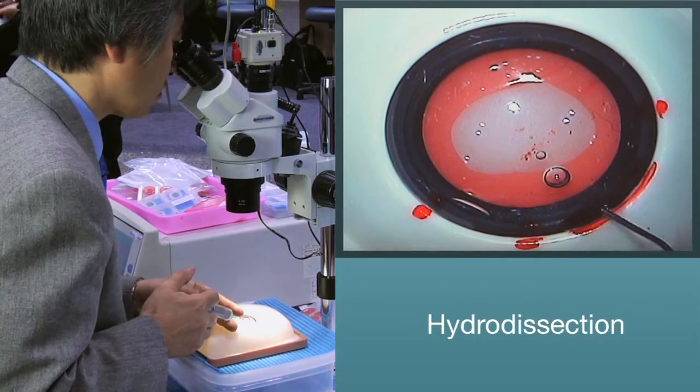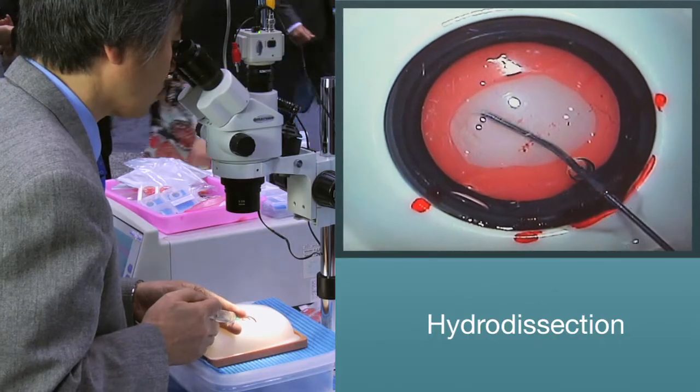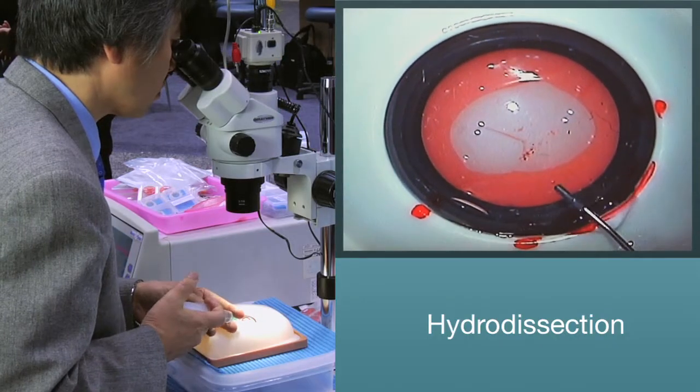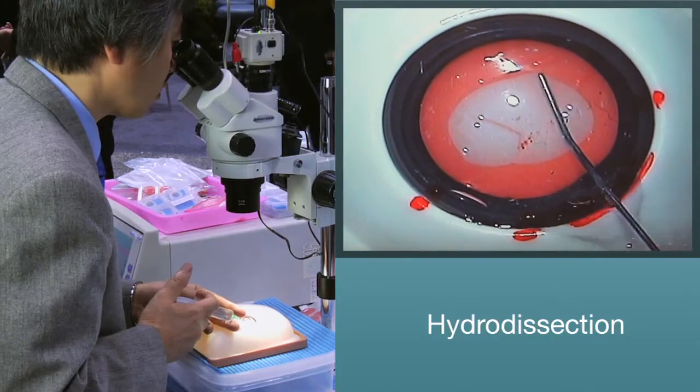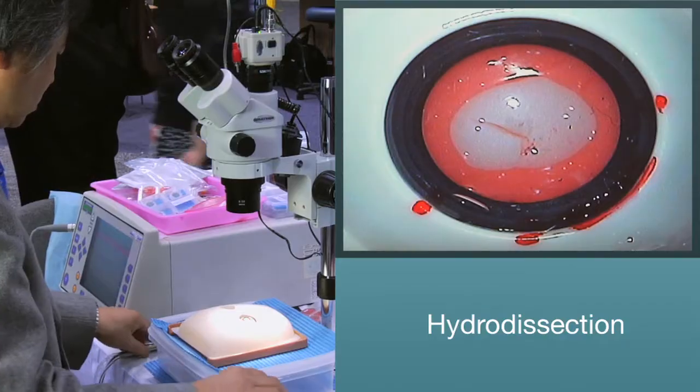After a successful capsulorhexis, you will then need to perform hydrodissection with the provided hydroneedle. To verify a successful hydrodissection, rotate the nucleus before moving on to phacoemulsification.